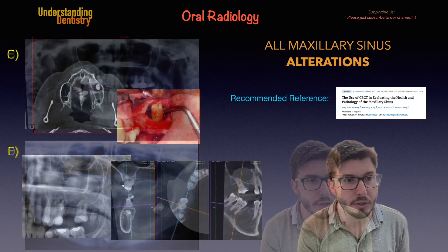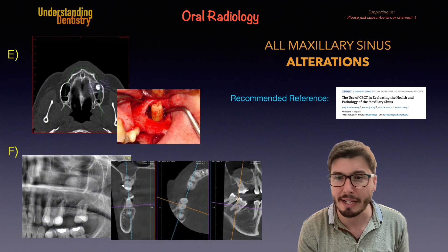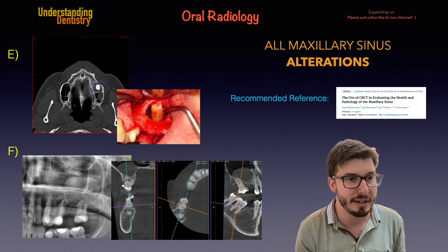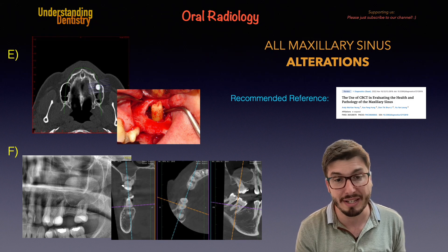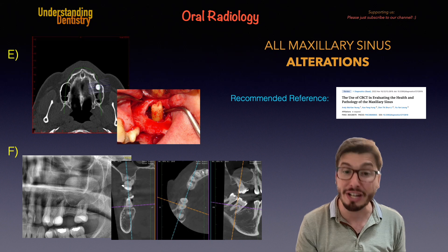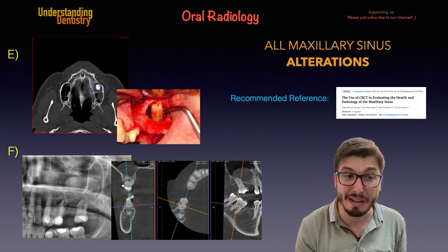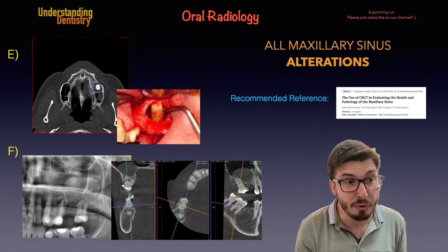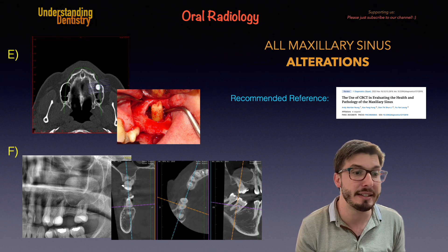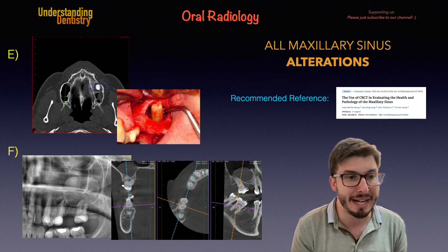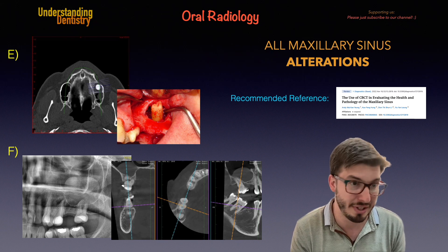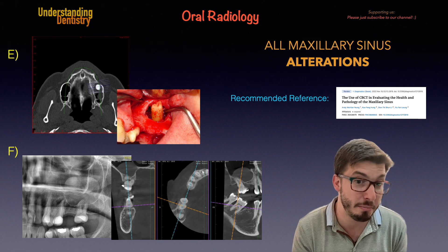All right, and just for us to finish, let's see two more cases. The foreign body of the letter E is being detected by this hyperdense image on the axial plane. The hyperdense image is on the left maxillary sinus. When I say hyperdense, I mean radiopaque — but that's 3D, that's CBCT, so we just say hyperdense.